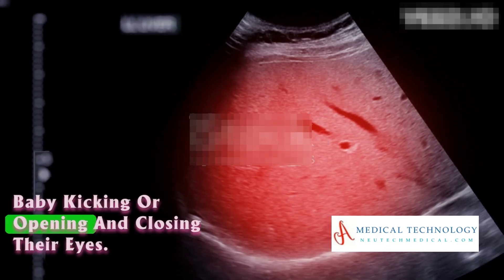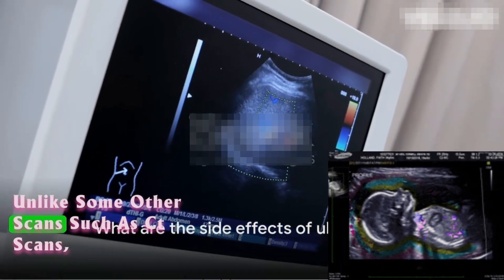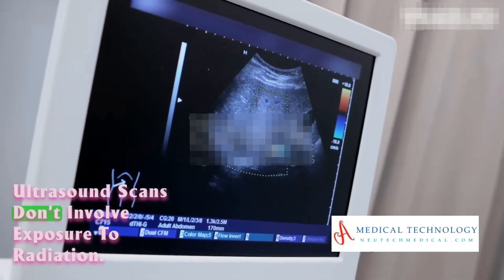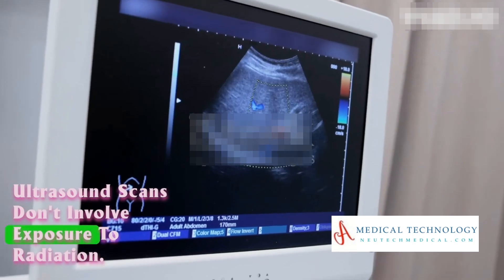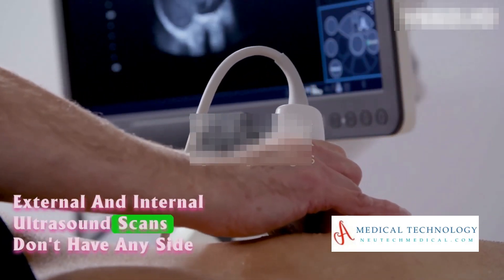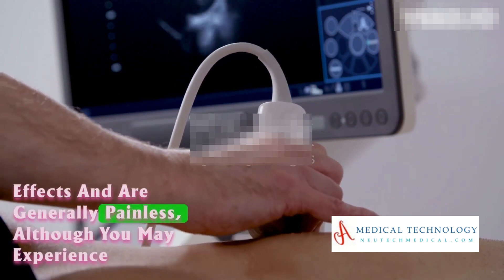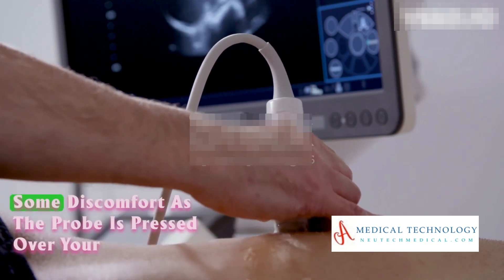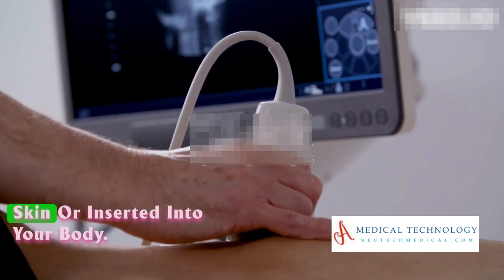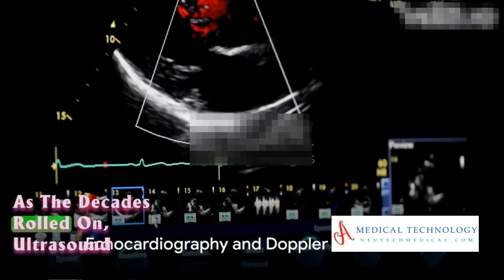Unlike some other scans such as CT scans, ultrasound scans don't involve exposure to radiation. External and internal ultrasound scans don't have any side effects and are generally painless, although you may experience some discomfort as the probe is pressed over your skin or inserted into your body.